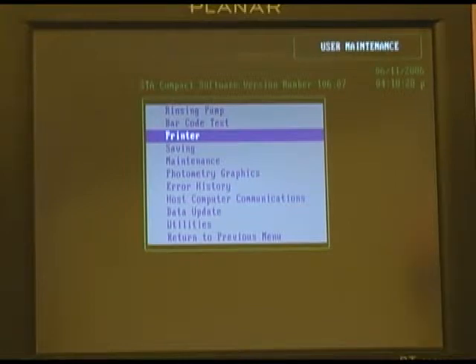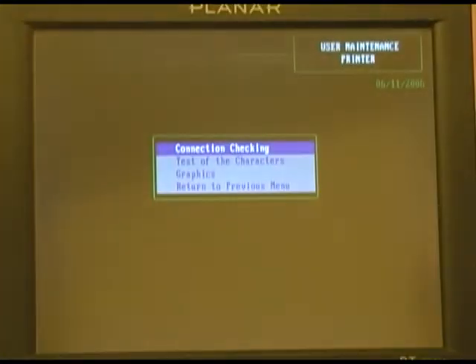Moving along to the printer, we'll highlight printer and press enter. Here's where you can check the connection to your printer to make sure that there's no printer issues if you're failing to print out correctly. You can also set up the instrument to print graphics in this application as well.